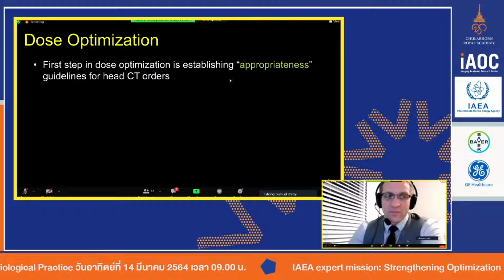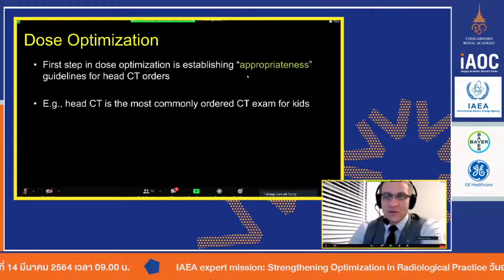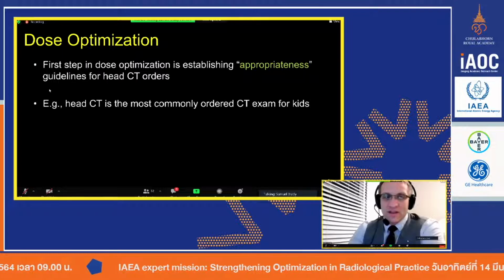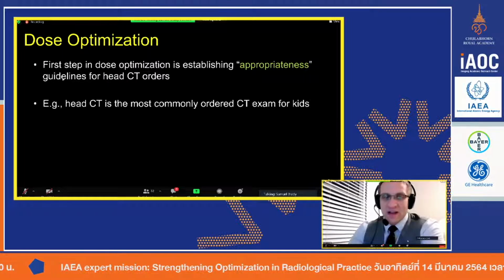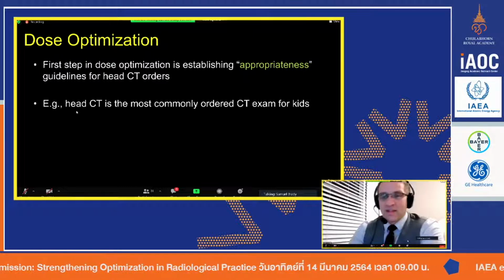All right, so the first steps in dose optimization and establishing what I would say, quote unquote, is appropriateness is setting specific guidelines for ordering CT. And so I'm just going to give you this example.